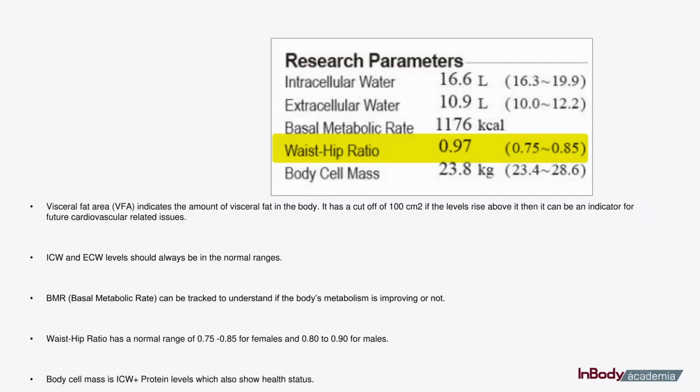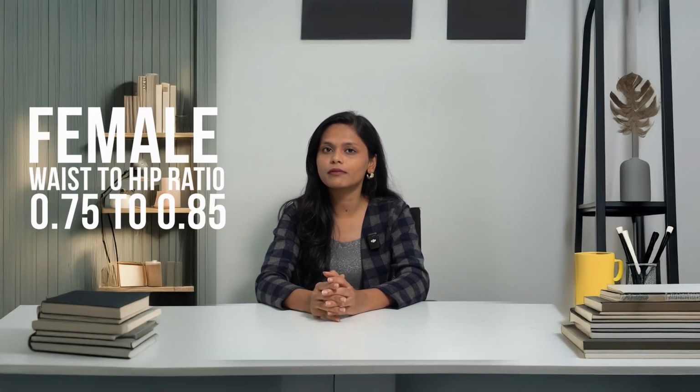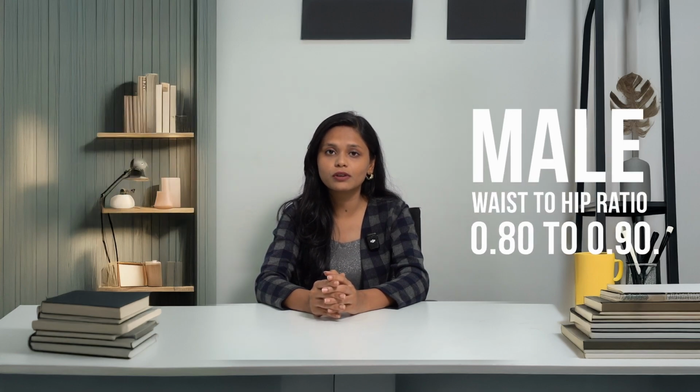Also, along with the visceral fat, you can assess what the waist to hip ratio of the individual is. In case she is a female, the waist to hip ratio has to be between 0.75 to 0.85. While if it is a male, the waist to hip ratio has to be between 0.80 to 0.90. If the waist to hip ratio is over these ranges and the visceral fat is also high, then there can be presence of maybe any future CVD related issues or any endocrine related issues. That's why prevention is better than cure.